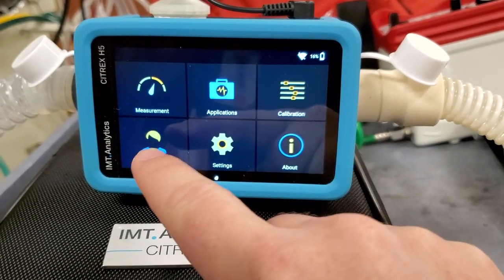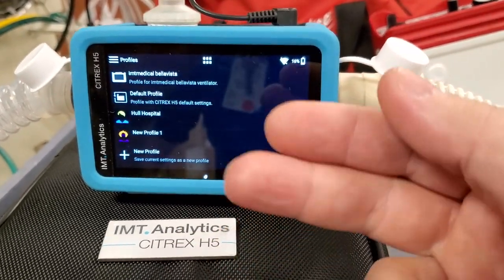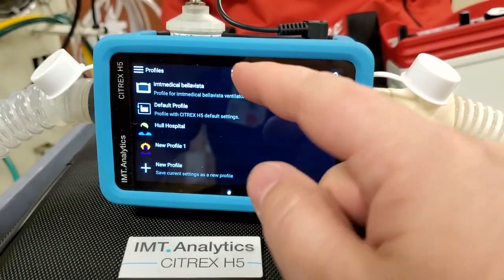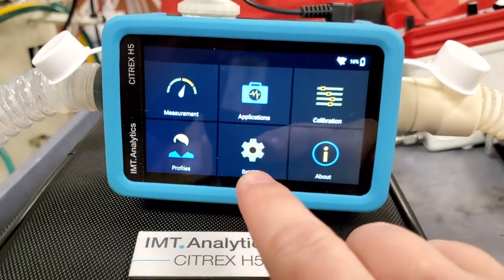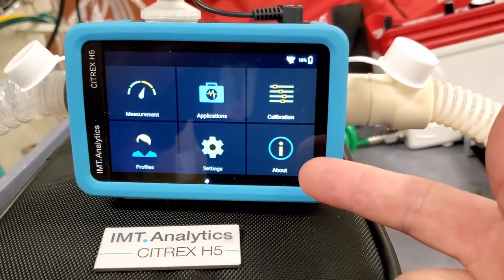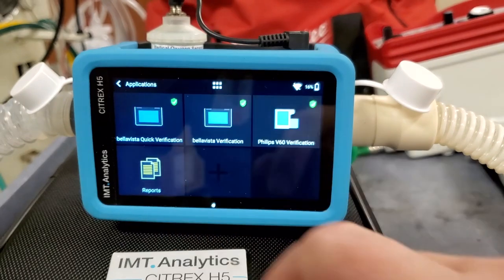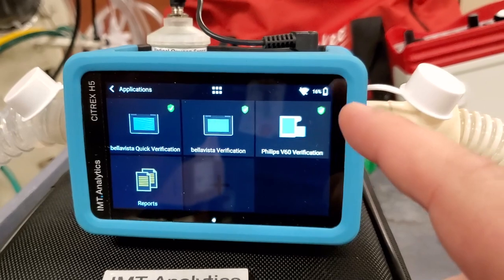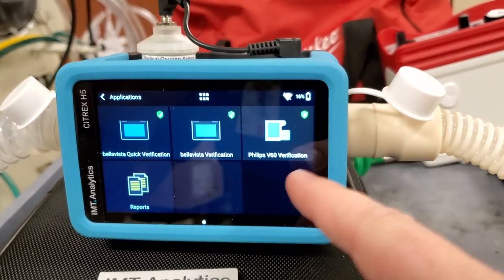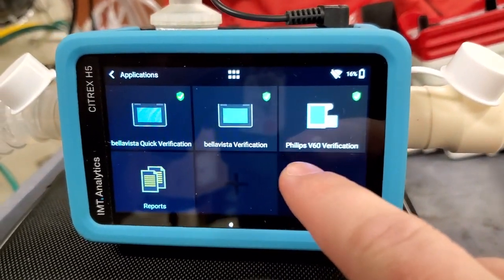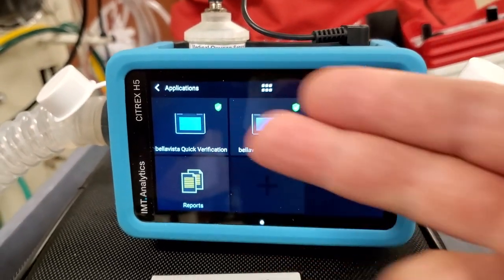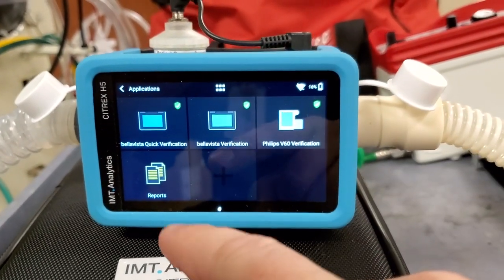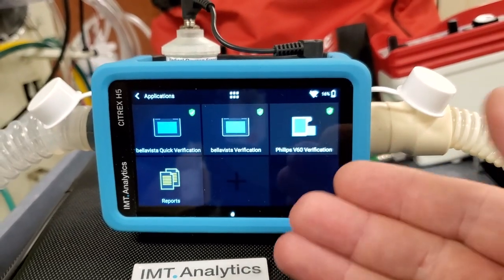The main place we're going to be is measurement. You can also set up profiles — say you do pediatrics or adults. You can see there are a bunch of hospitals already set up. In settings you can see calibration data. One of the things I think is unique: you can get profiles or set up procedures for ventilators. I've got the Philips V60 verification and Bella Vista already installed, and depending on the profile there will be different ventilators preloaded.